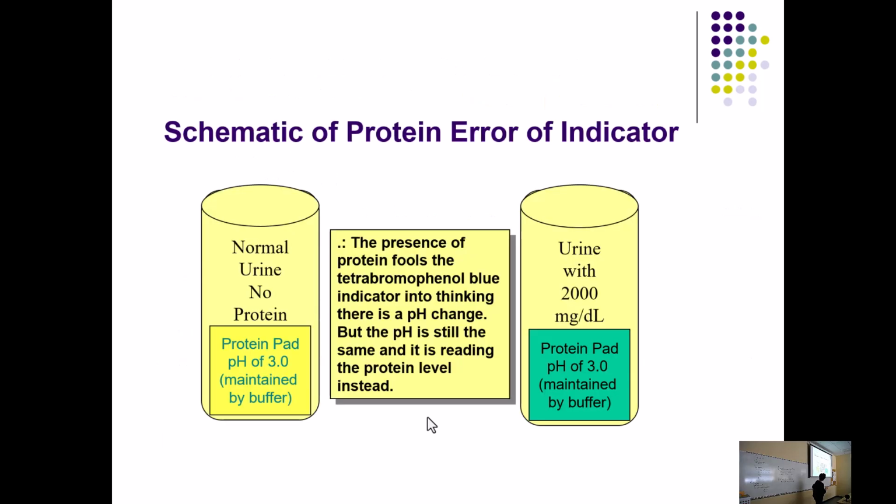Now, one of the problems we have is if we have a highly alkaline pH, it's going to override the buffer. So remember in chemistry, you did these tests where you did drip, drip, drip, drip to see how much it took to override the pH to a certain point. You had to add a whole lot of base to turn the acid pH to change the number. That's kind of what this is. It's good to a certain point, but once it hits a certain point, it's gone.